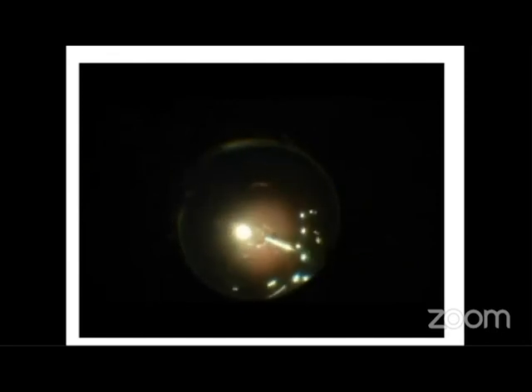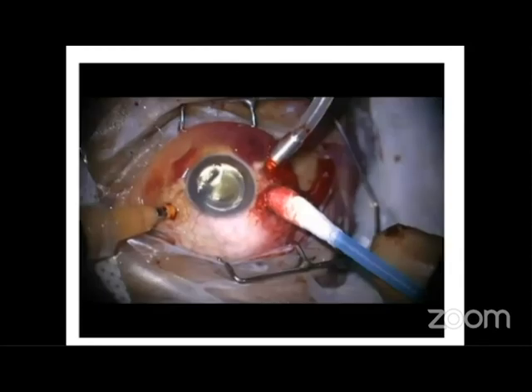Relaxing retinotomy is done adjacent to the scarred area. As in ARN, it is not mandatory to dissociate the atrophic area from the normal retina, as chance of proliferation is less. Fluid gas exchange is done. Endolaser is done along the relaxing retinotomy, the breaks, and 360 degrees to safeguard the posterior pole. Silicone oil is injected.